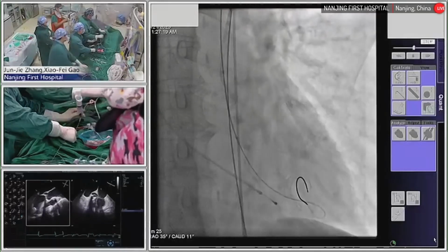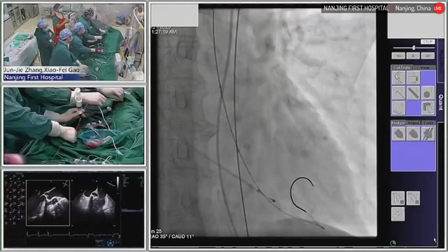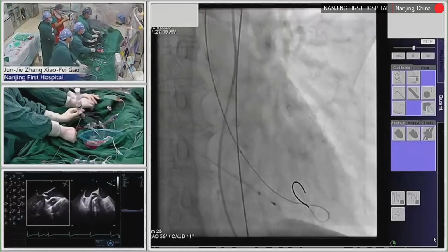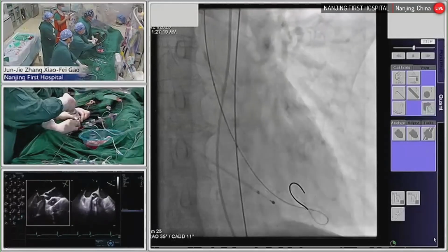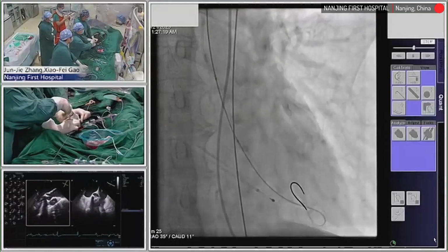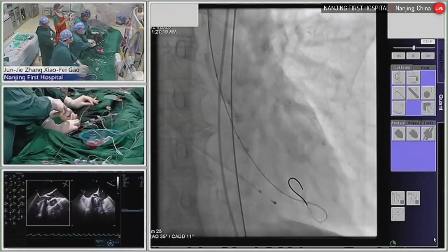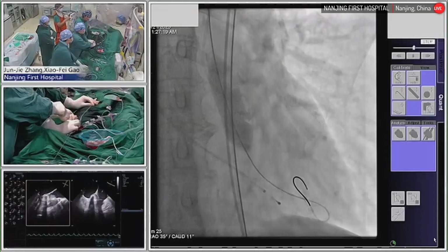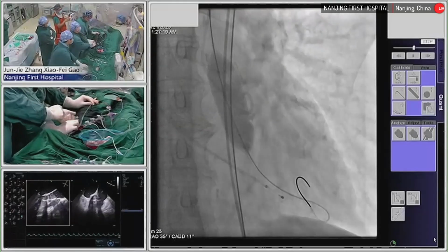Okay, smoothly. Sure. Okay. 100. 118. Up. Working well. Sure. Wow, very eccentric. You see? Yeah.